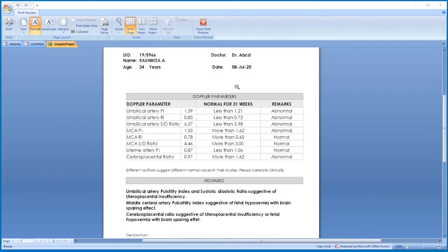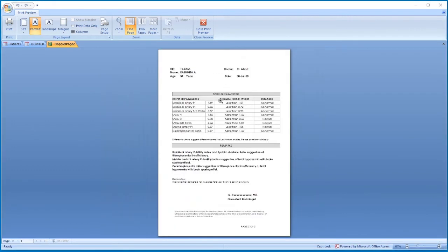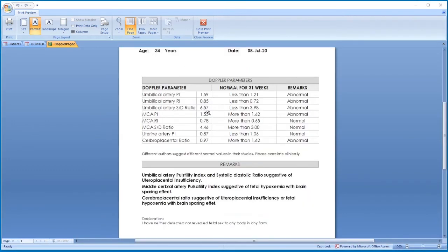This is the doppler report of another patient. The doppler parameters are printed here. This particular patient is 31 weeks of gestation, so the normal values for 31 weeks are printed here.